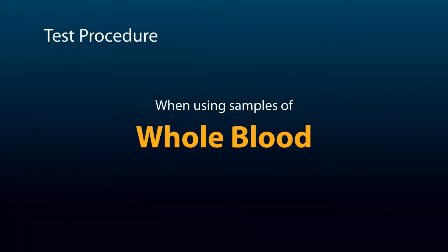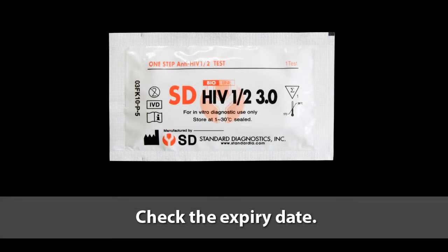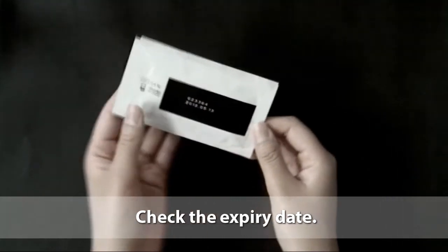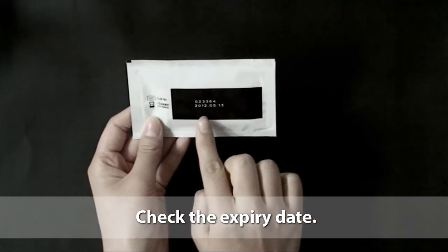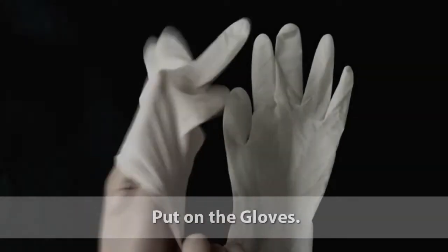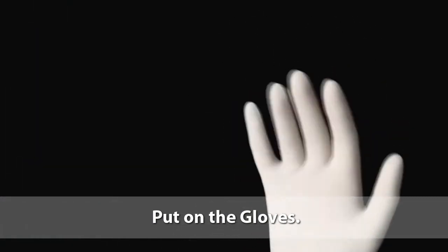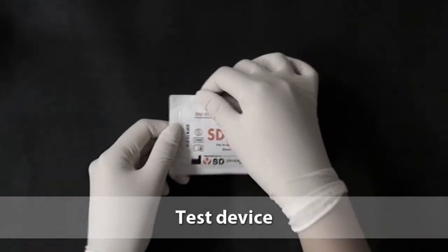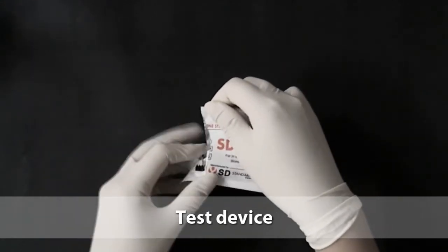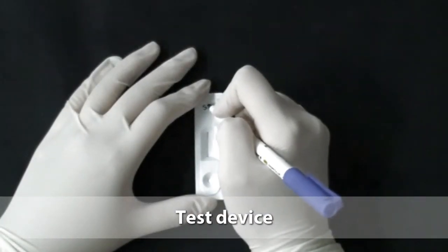When using whole blood as a specimen, check the expiry date on the back side of the test pouch. If the expiry date has passed, use another kit. Put on the gloves. Remember, use new gloves for each patient. Open the test pouch and set the test device. Write the patient's name on the test.